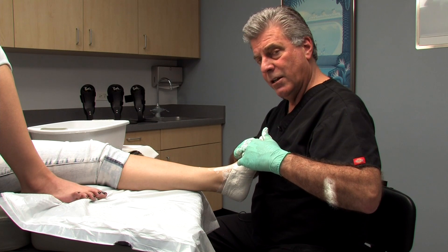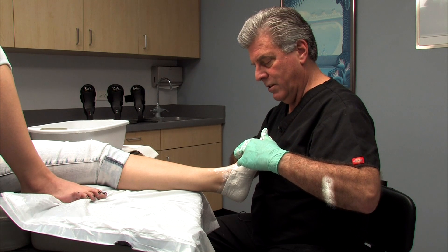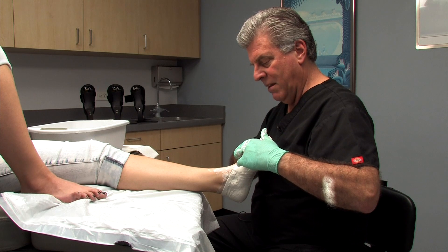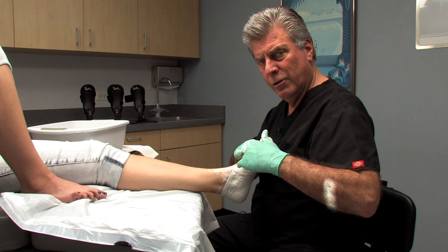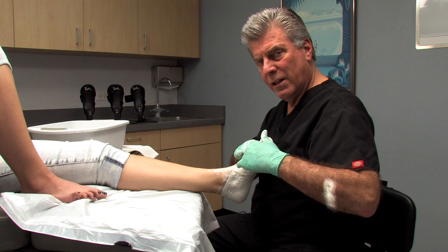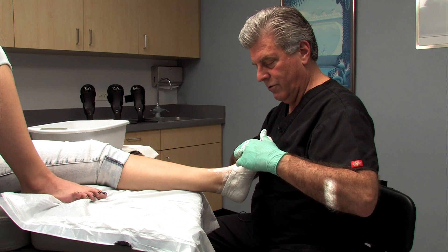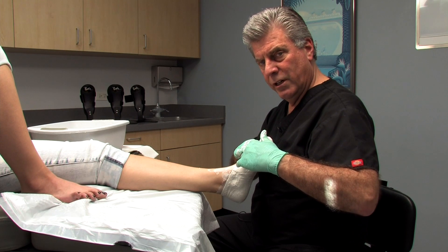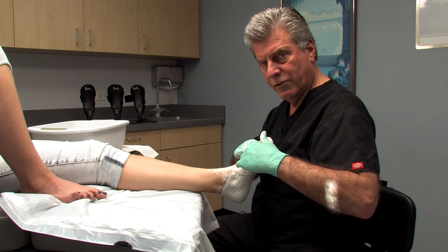You only need to hold this for about a minute, because you've waited appropriately before applying the plaster and getting everything molded. We usually put the water at room temperature, or maybe slightly warmer — you don't want it too hot because it will diminish the amount of time you have to set up. As I'm holding this foot in subtalar neutral with the mid-tarsal joint locked, I'm feeling the plaster cure and harden. We're just about done, but make sure it is fully cured before attempting to remove it — you don't want to distort the cast.